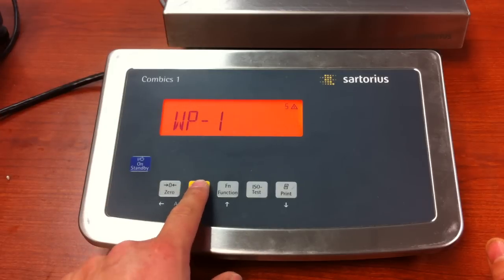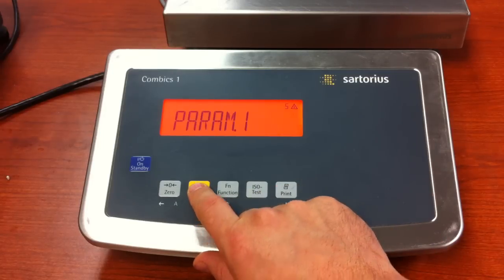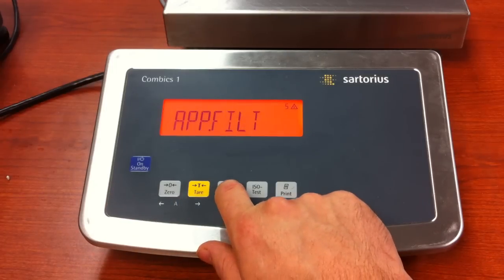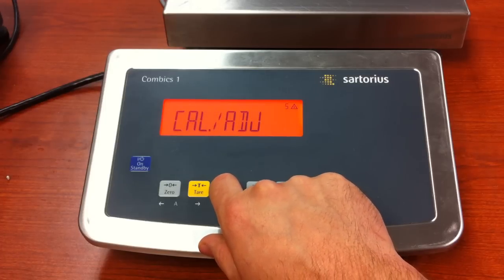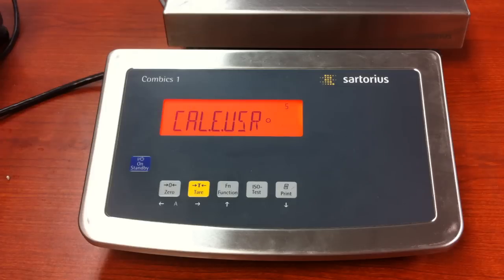Press and release the tear key. Press and release the tear key again. Now we want to setup the user-defined calibration weight in parameter 1, so press the tear key. And now we are going to press and release the function key.